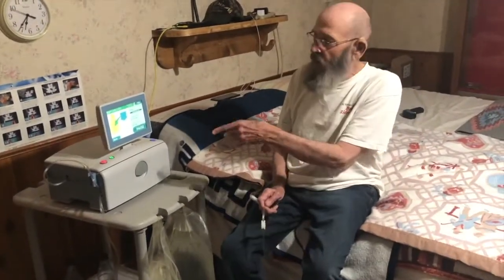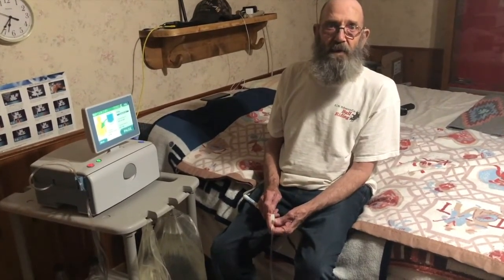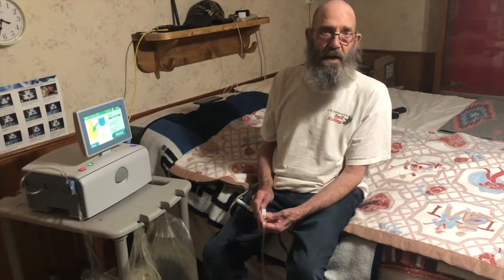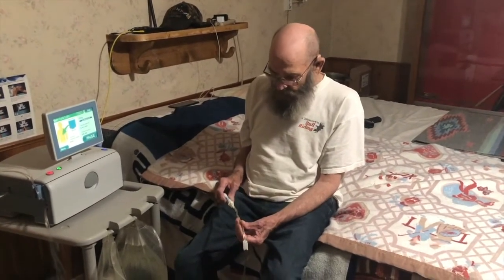What we did already tonight is already at the clinic, so when they come in first thing tomorrow or Monday, they can look up and see how everything went. So it automatically downloads into the system to town. Pretty cool.